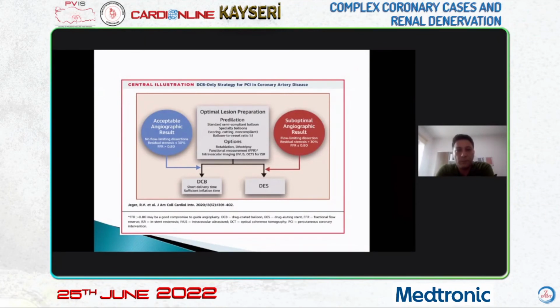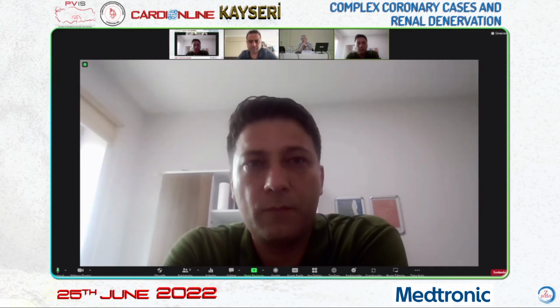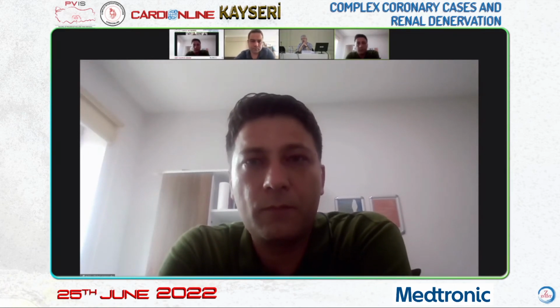Another important point is that in preparing the lesion, if we act too aggressively, dissection problems may occur. Therefore, knowledge of the anatomy of the vessel is required.